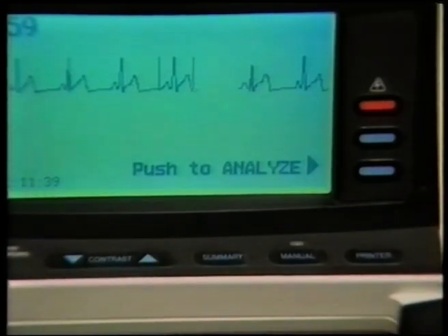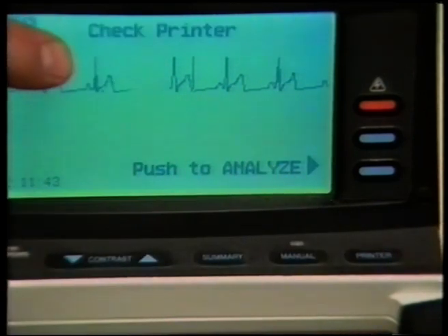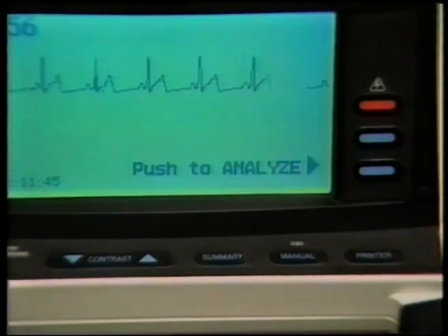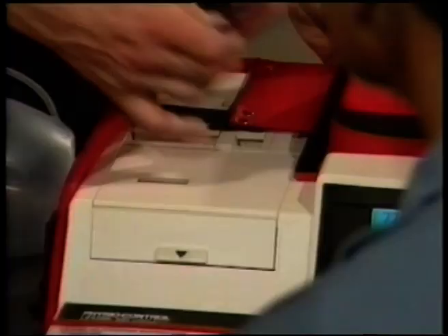The printer will not operate if the paper is missing, jammed, or if the recorder case is open. If you push the printer button when there is no paper, for example, a check printer message flashes. This display message will not affect device operation, including code summary critical event retention.